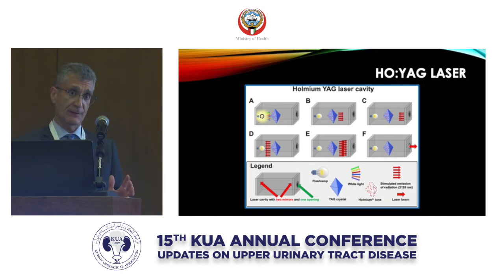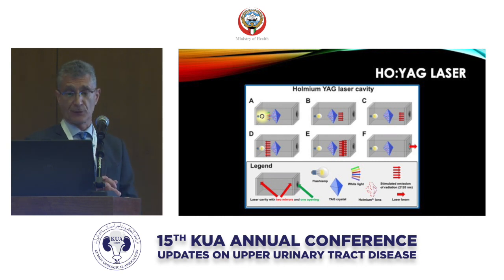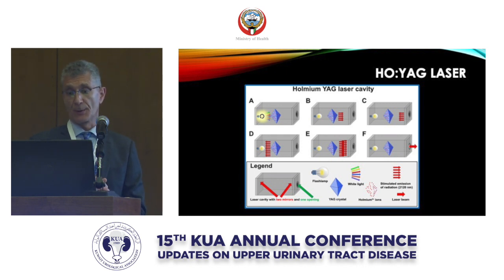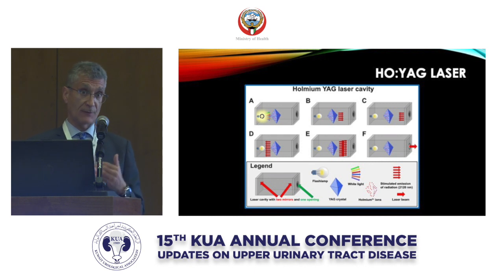So a number of publications have now looked at what are the differences that are unique to these two devices, and what are the important differences. So this slide here just to highlight those. And so wavelengths, although roughly very similar, actually the effects are quite a bit different, which we'll talk about in a moment. The thulium fiber laser has much more variation in terms of energy ranges that you can use, as well as the pulse frequency. And there may be some clinical advantages to that as we speak about later. The energy source, a little bit different, and again, why that's important is thulium fiber laser, it's air-cooled, so it's a much smaller box, much more portable. It's a standard power outlet. You don't have to modify your operating room as we would have to with high-power holmium lasers.